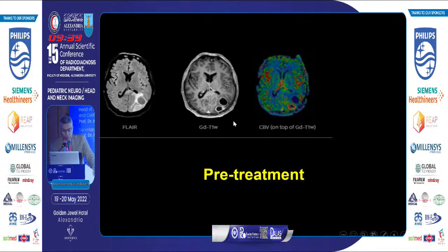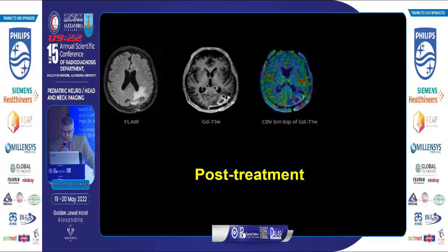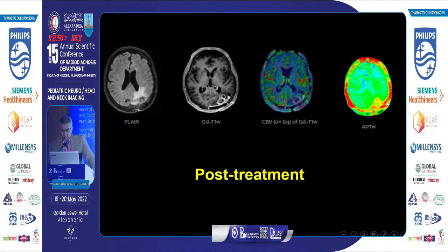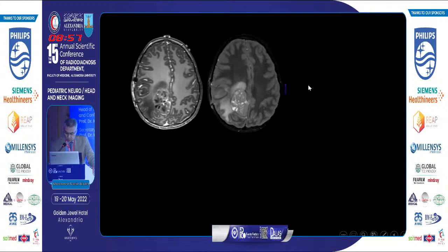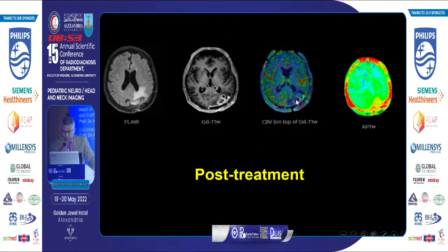A patient resected for glioblastoma multiforme showed an enhancing area at the operative bed during follow-up. MR perfusion revealed hyperperfusion consistent with tumor recurrence. After receiving an anti-angiogenic chemotherapeutic agent, perfusion showed hypoperfusion suggesting good response — but amide proton transfer showed high signal within the operative bed consistent with tumor recurrence. Brain biopsy confirmed recurrence. This was explained by the anti-angiogenesis effect of the chemotherapy leading to hypoperfusion despite active tumor tissue at the operative bed. Therefore, amide proton transfer is superior to perfusion in assessing therapeutic response.